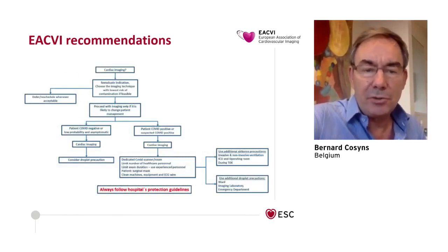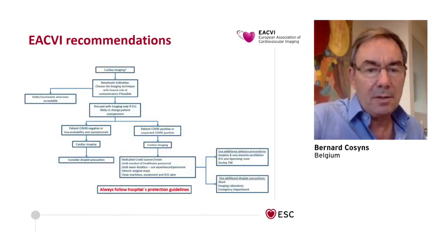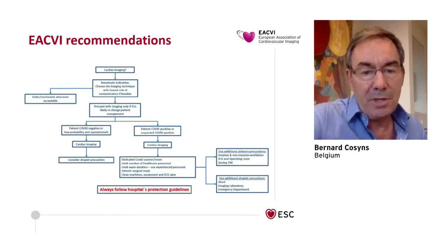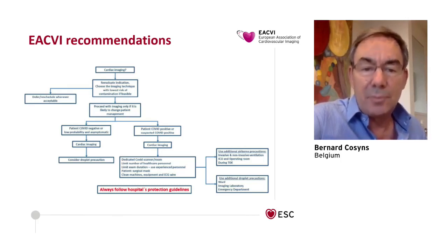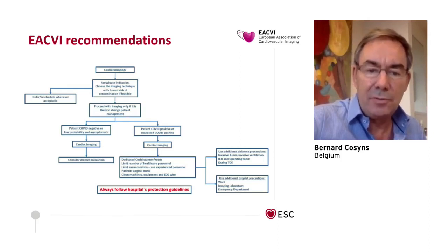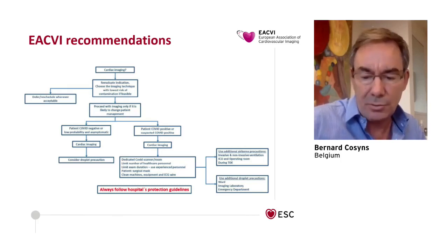When you have a patient with a COVID infection and you consider cardiac imaging, you have to carefully consider the indication because of the risk of infection for the personnel. If you have a patient who is COVID positive or highly suspected of COVID and you have to proceed to cardiac imaging, you have, of course, to apply different precautions and to follow the rules from your own hospital. If you intend to proceed to other imaging modalities like transesophageal echo, you can increase the risk of airborne dissemination, and therefore you have to take some additional precautions.